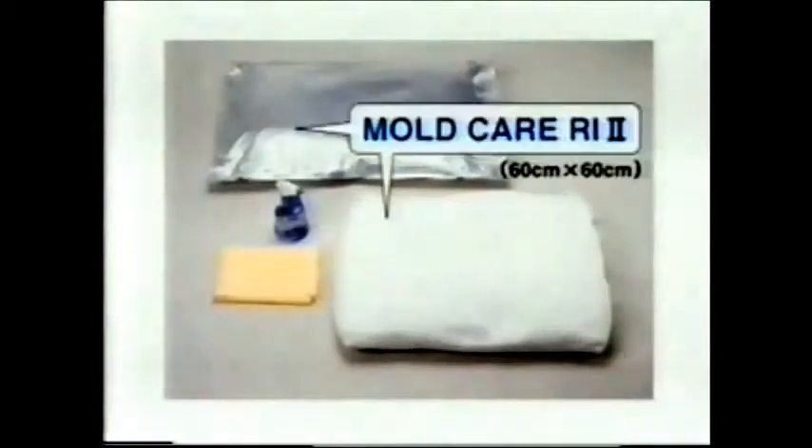The following items are required for the production of MoldCare RI-2. In this section, the molding procedure for BR-3 for chest, trunk, and pelvis regions is introduced.